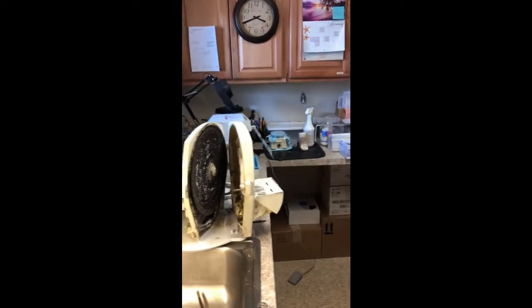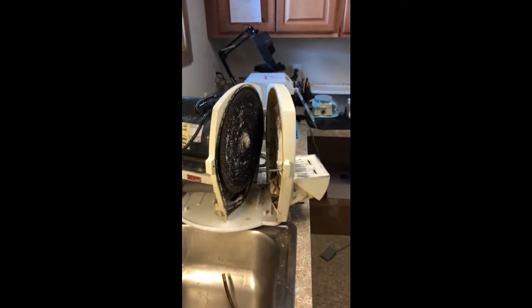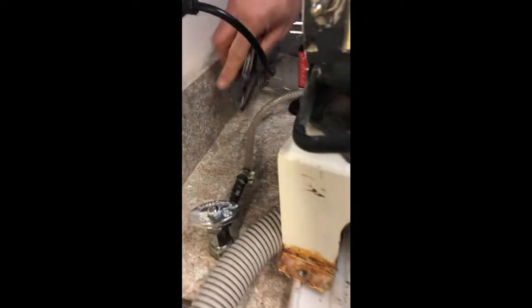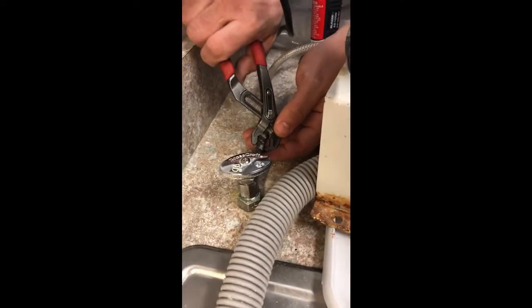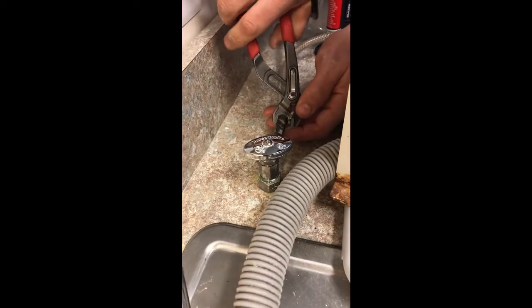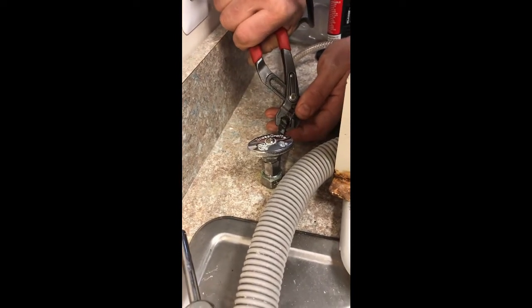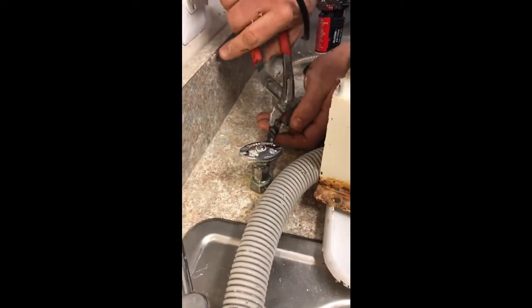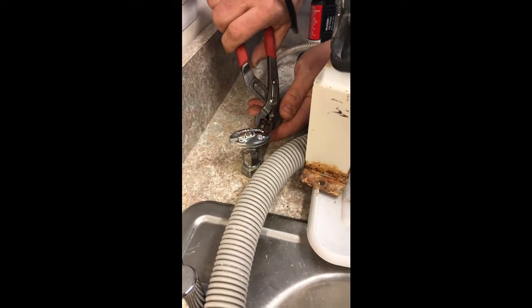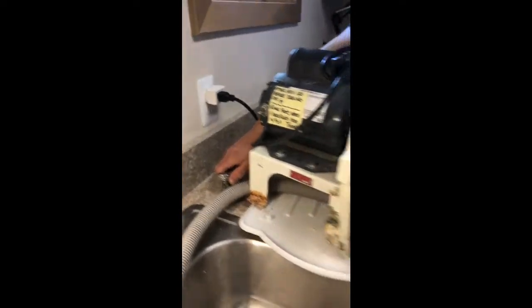Let me grab a pair of pliers and open this up a little bit. There's a little bit of a crimp flow adjustment here, so we're gonna do a little bit of an adjustment back. We're just gonna go ahead and adjust that just a little bit. Funny we would call this an adjustment, but okay, like so. So now let's see if that flow is any better.